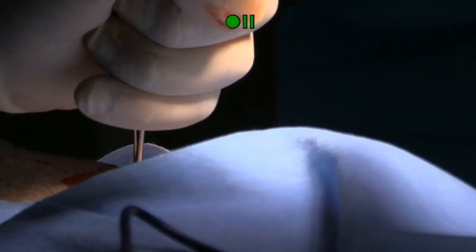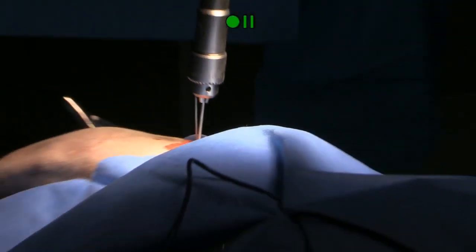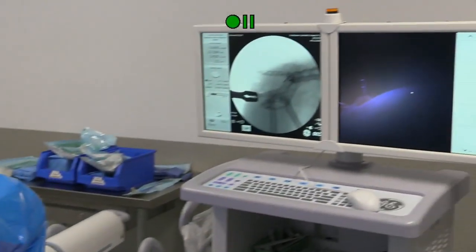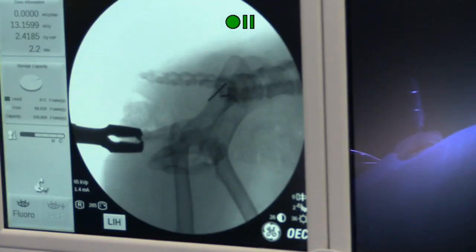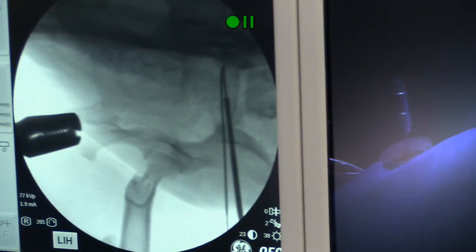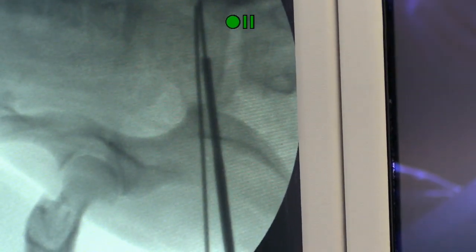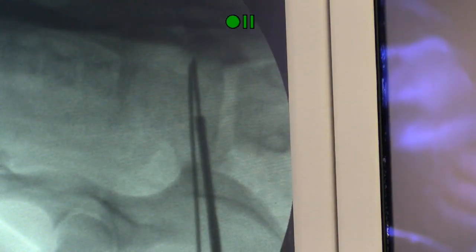And this feels solid all the way through, which is a good thing. So I'm just going to leave that on there. I'm going to come back and check where this is going and how deep I am. You can see that that drill bit is going right over the pin.